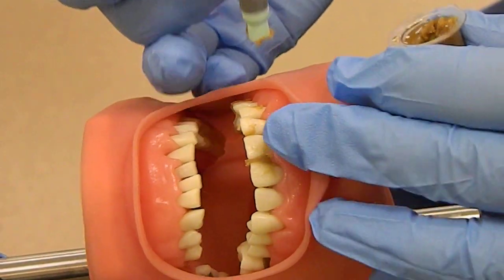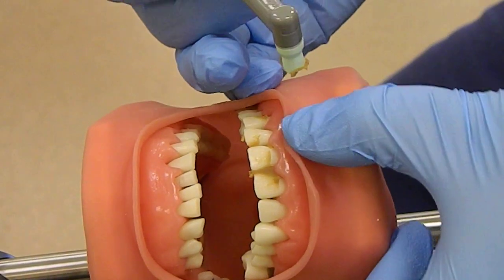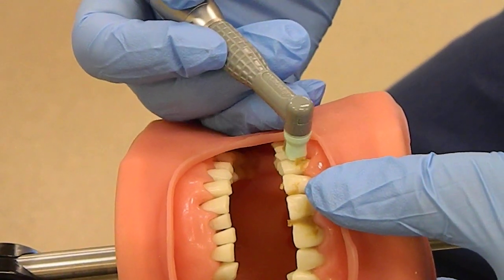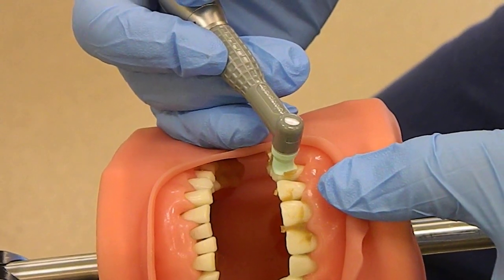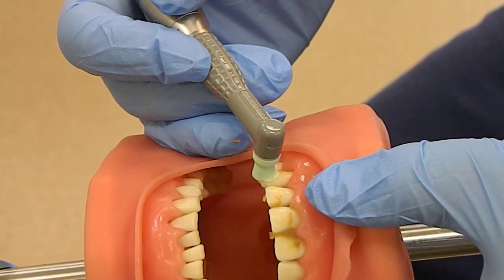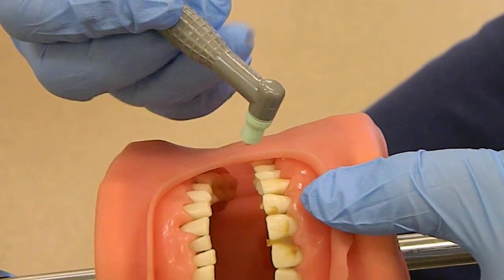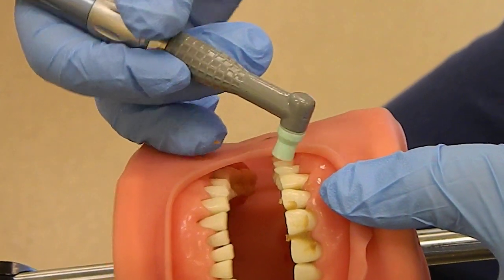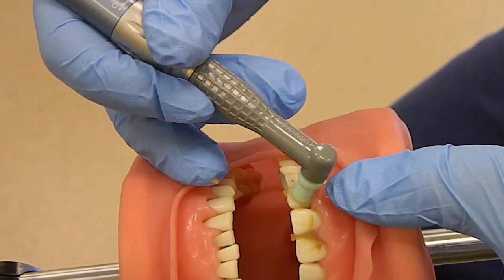We're going to start with the technique. We're going to go down the center and then do side and side. When you're pressing the cup against the tooth, you want to flare the cup toward the gum line like this. And then you want to make sure that cup flares into the inter-proximal space, just like that.